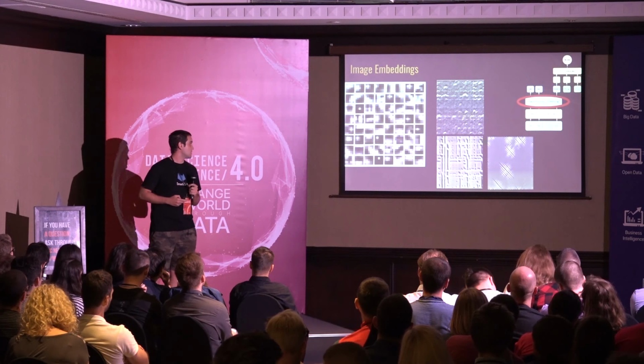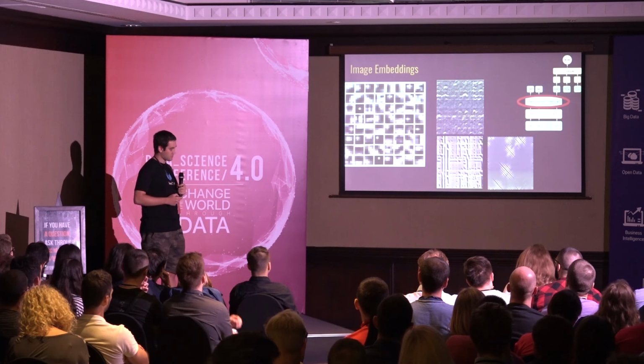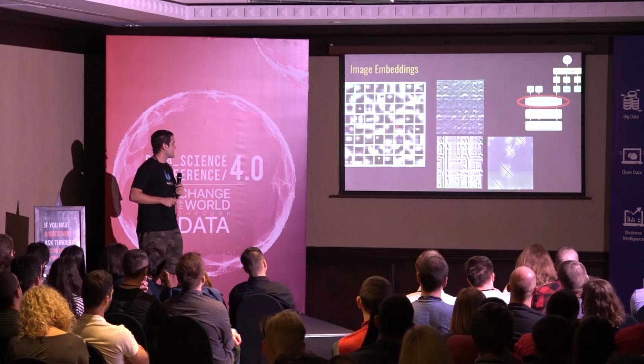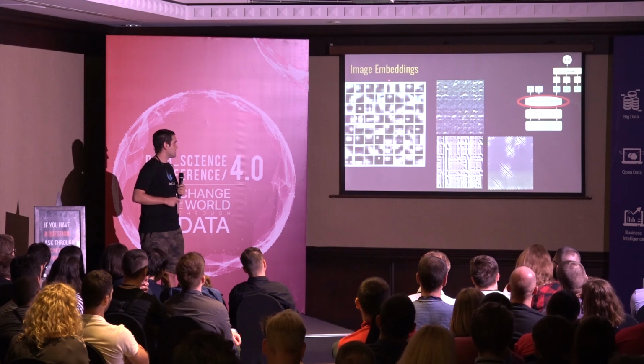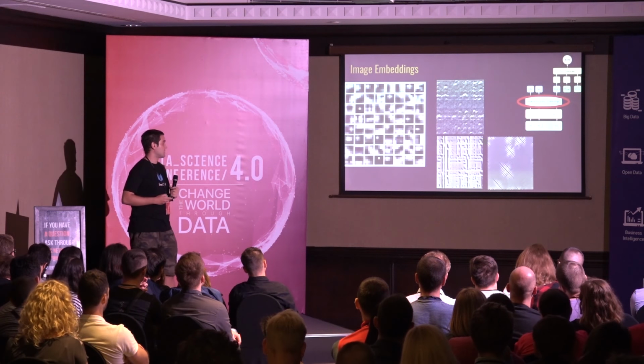And these are filters from the stack denoising autoencoder. These are filters from the first layer, and we can see the network isn't fully converged, but we can see some vertical edges, horizontal edges, diagonals, some black and white changes, etc.